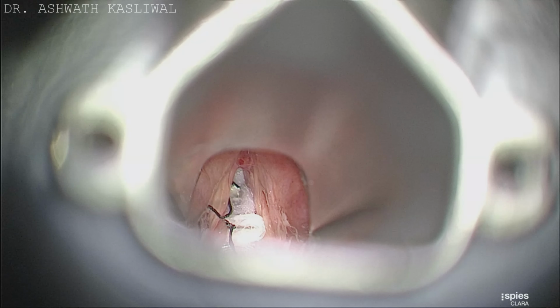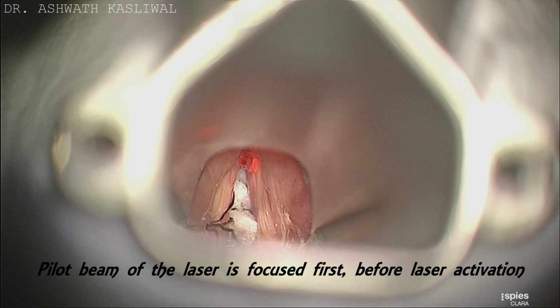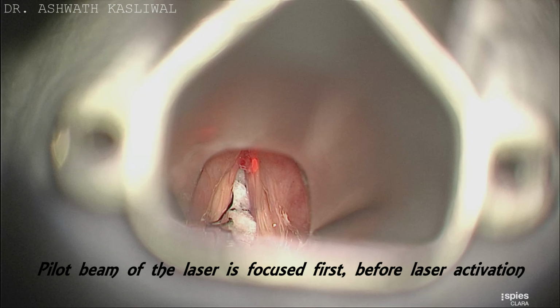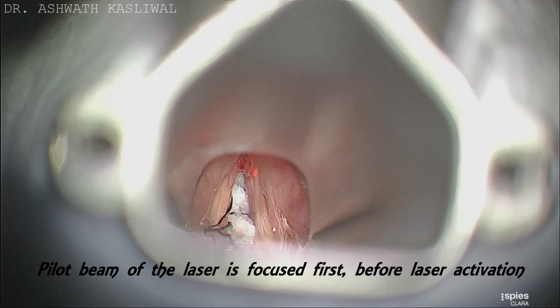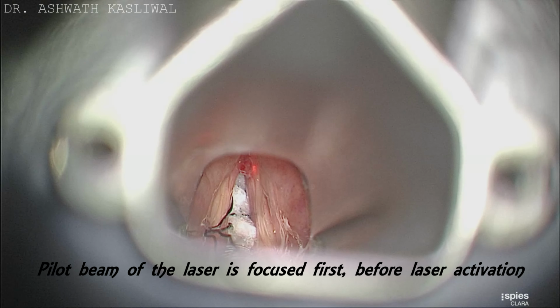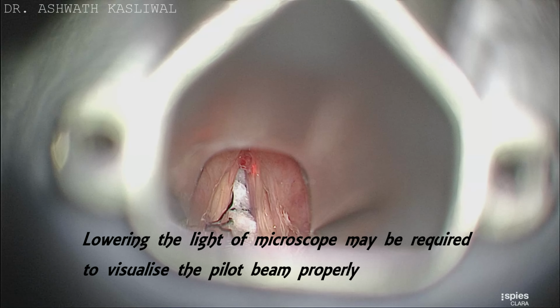Initially, it is important to focus the pilot beam of the laser. While focusing the pilot beam, you may be required to lower the brightness of the microscope in order to visualize the pilot beam properly.